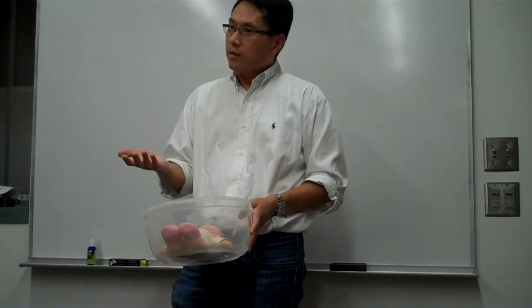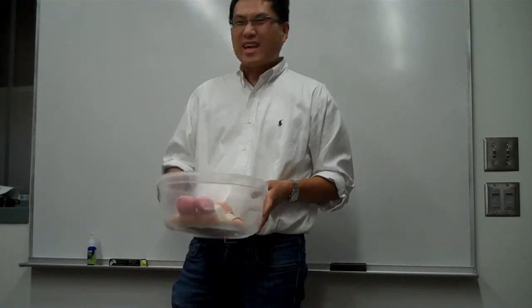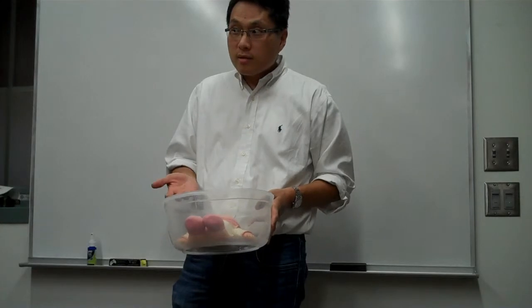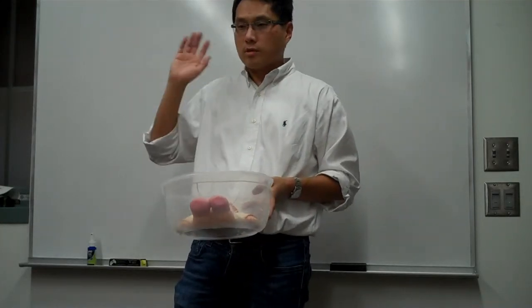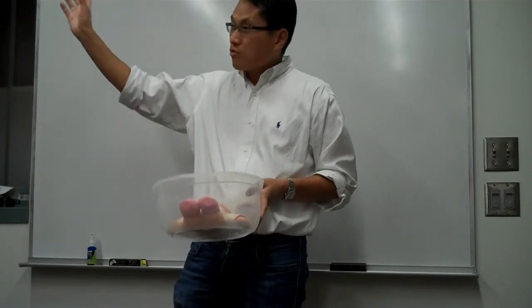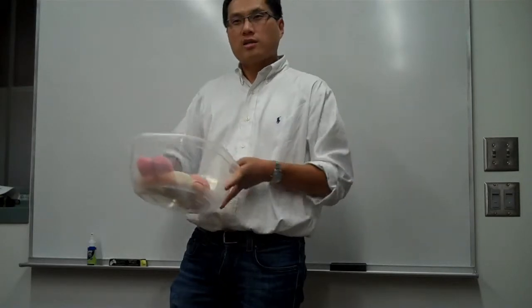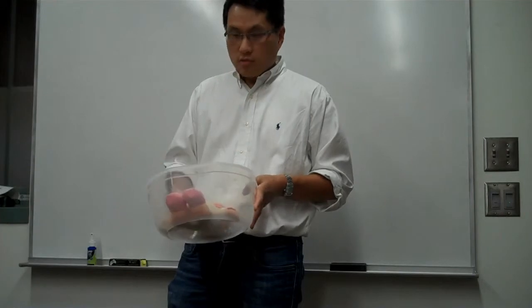And again, the key point is it has to be very low cost. The simpler, the better, because the other thing we find is that there's a lot of tools that are very expensive, and they can't afford any of them. The cheaper, the better. The easier to make, the better. The easier to transport, the better. The area we're working with, and a lot of these areas in the world are like this, they're in very rural areas. So to get there is going to be a long car ride. And you don't want to make something very complicated. So easy to transport, very simple.